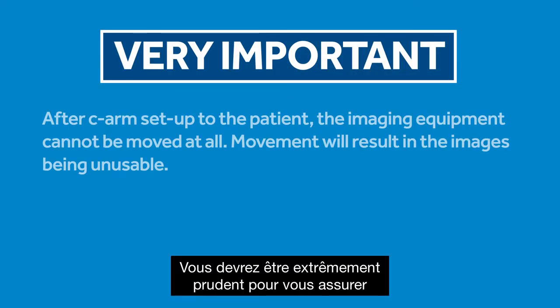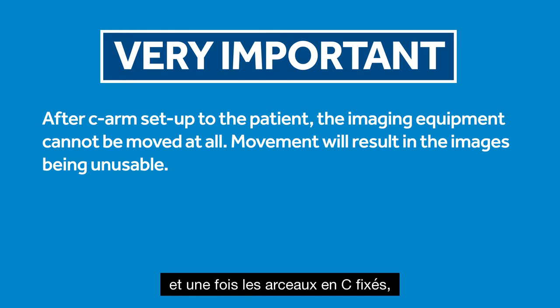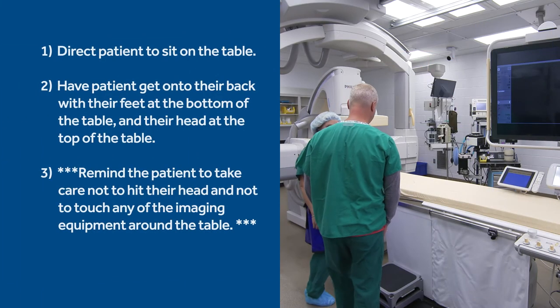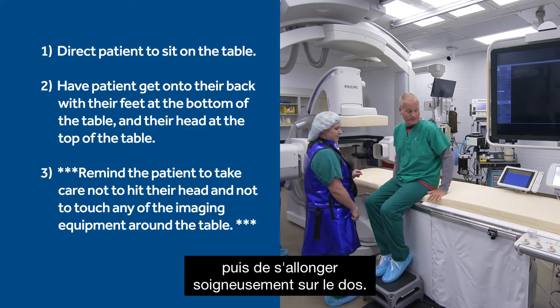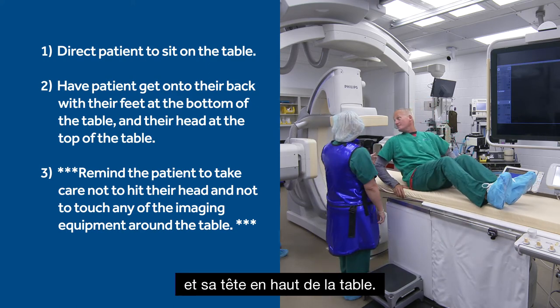You'll need to be extremely careful to ensure that after the arm movements are confirmed and the C-arms have been set, the equipment is not moved at all — either by you or by the patient. Movement will result in images being unusable. Please instruct the patient to sit on the table and then carefully lie down onto their back. They should position themselves so their feet are at the bottom of the table and their head at the top.